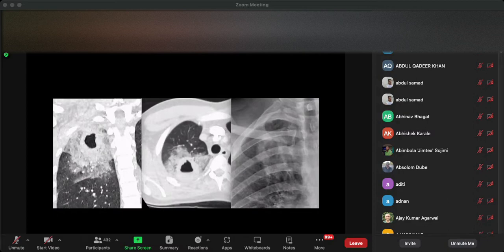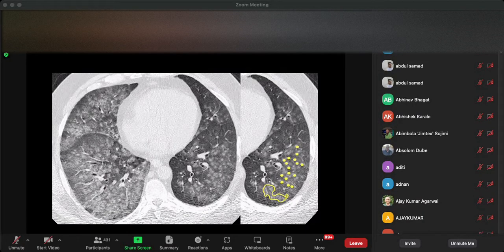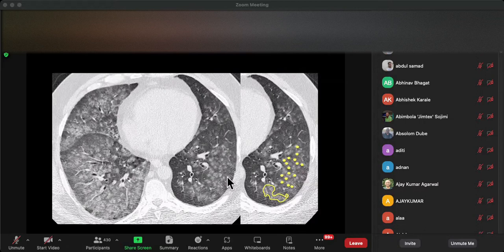Oh, sorry, before I forget, centrilobular nodules, hypersensitivity pneumonitis, that's the main one. But anything that involves the airways, and that could be endobronchial tuberculosis, it could be thoracic lymphangiectasis, where you get lymph going into the bronchus due to a problem with the thoracic duct. And this is thoracic lymphangiectasis as it happens, which is extremely rare, but it's just a great example of centrilobular nodules. The number one diagnosis for something like this would be hypersensitivity pneumonitis.